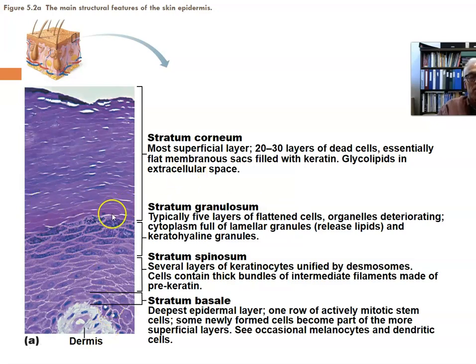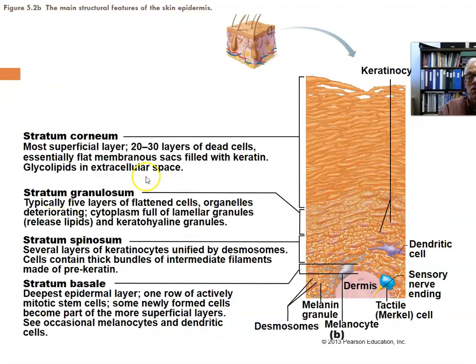All this epithelium here is a factory to generate the stratum corneum, the cornified layers, which are the actual functional barrier of your skin, the exterior surface of your body. It's resistant to microbes, bacteria, fungi, and so forth. It's resistant to chemicals. It protects you against water loss. It keeps the water inside your body. Otherwise, the water would just weep out of your body and you wouldn't be able to maintain your fluid volumes. So that's the epidermis.